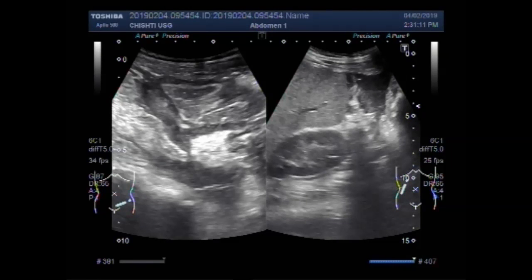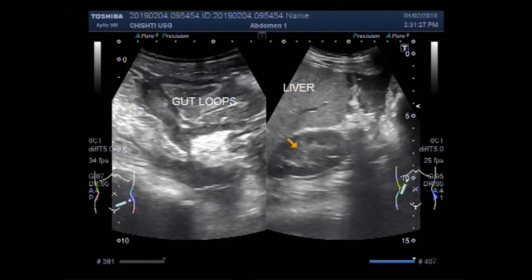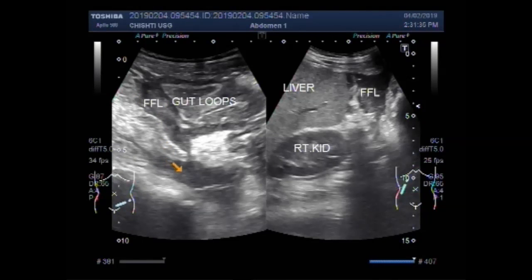Until now I used the convex probe of 5 MHz. These are gut loops, liver, this is the right kidney, and this is free fluid. This is also free fluid, and this one is also free fluid.